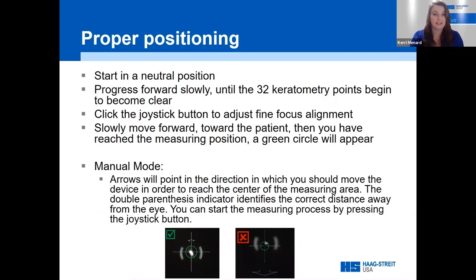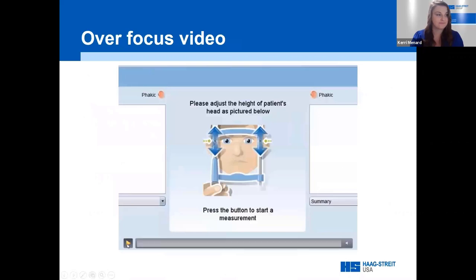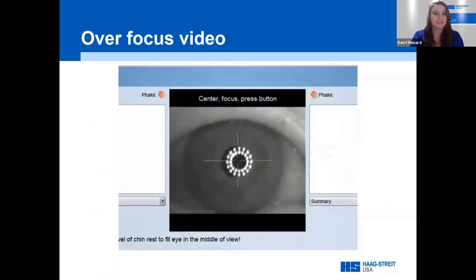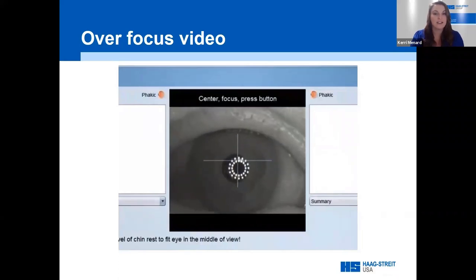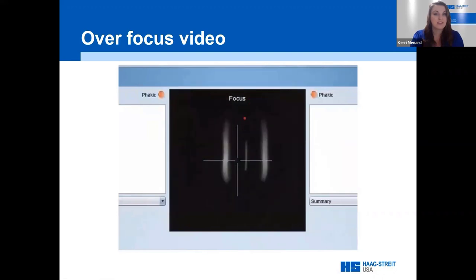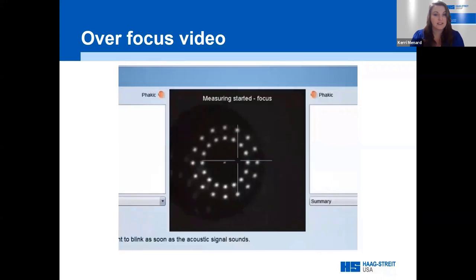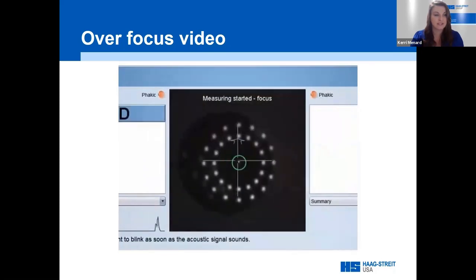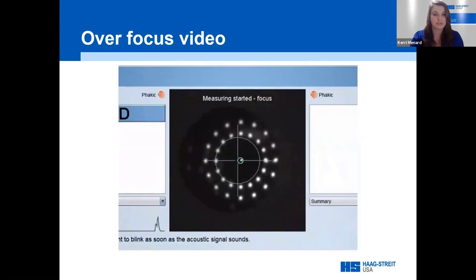Here you can see the operator starting a little too close to the patient — the LenStar is not all the way back in a neutral position. When they click the joystick to enter fine focus, the operator has to determine whether to move closer or farther away. They move closer and the double parentheses become blurrier, so they pull back and the green light does track on. In summary, if the operator starts defocused and slowly progresses forward until the circles become clear before clicking the joystick, the only direction they need to move afterward is closer to the patient's eye.